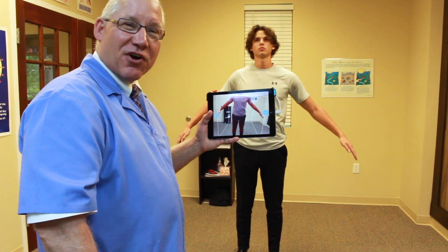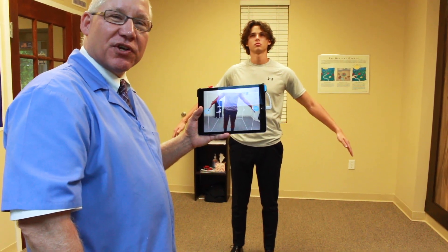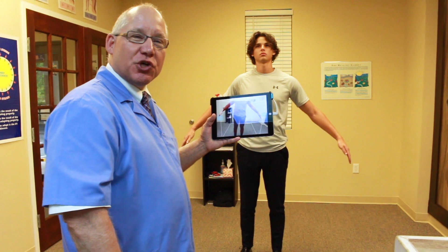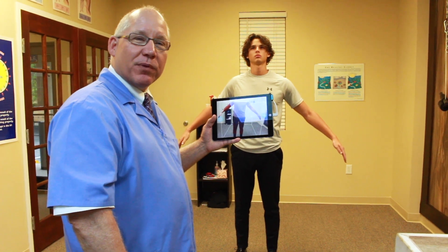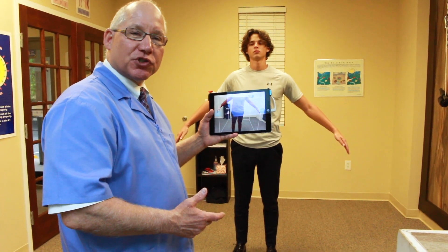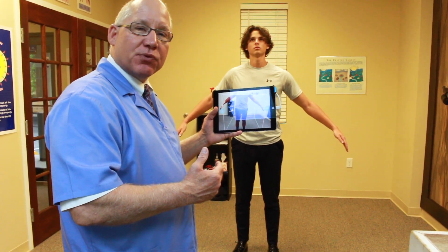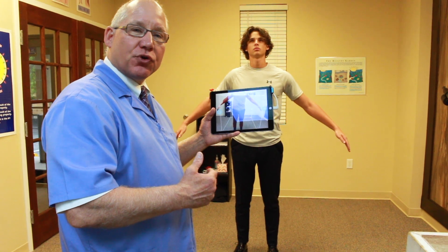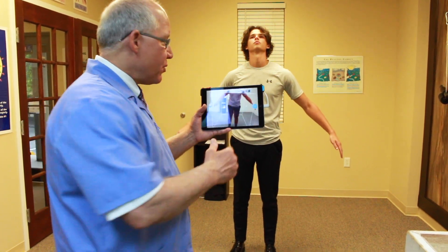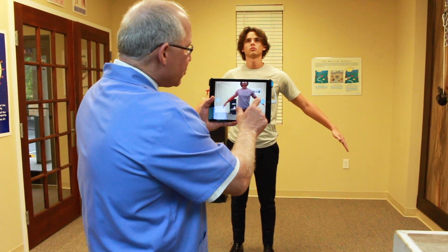Hello, this is Dr. Jay Hartley of the Hartley Chiropractic and Scoliosis Center. Today we're going to be teaching you about the scolibrace scan. We're going to do a structural scan and then that information will be used to create a scolibrace. So I'm going to go ahead and show you how that works.